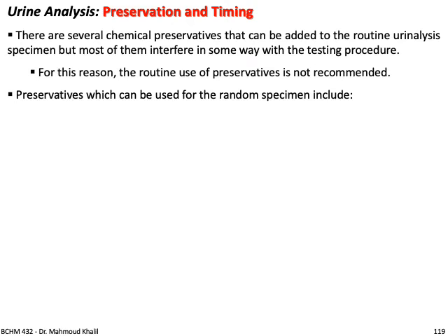Hello. We'll continue our lectures about urine analysis, preservation, and timing. There are several chemical preservatives that can be added to the routine urine analysis specimen, but most of them interfere in some way with the testing procedures. For this reason, the routine use of preservative is not recommended. That means you need to analyze it fresh.